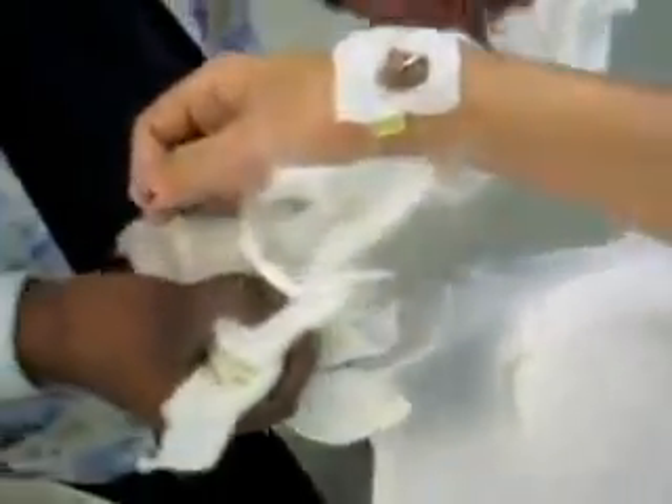It's on my thumb now. We did it! Don't smell anything? No, it's pretty good. You did an excellent job of keeping it clean. It's a cat-mouse game. See the pins there? Ooh, I see the pins. Haven't seen this arm in like six weeks.